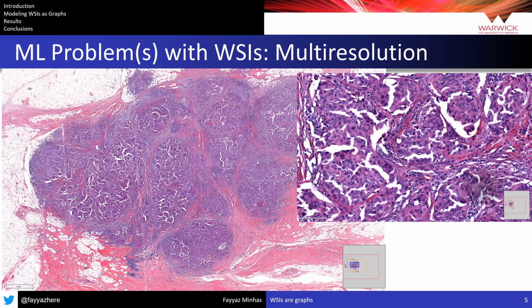So what I've seen pathologists do is that they're able to zoom into the image at different levels to identify different patterns. Depending upon the type of disease they are screening for or the hypothesis they have in their mind, they may zoom to a greater depth within the image and identify those patterns within a given image. Some of the patterns can be pretty obvious at a pretty high level as well. So this multi-resolution nature within the machine learning model is key to developing effective solutions.